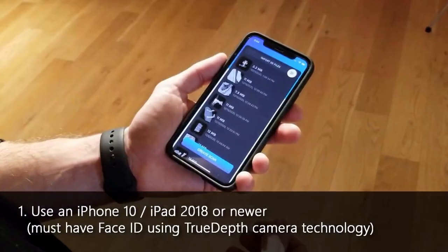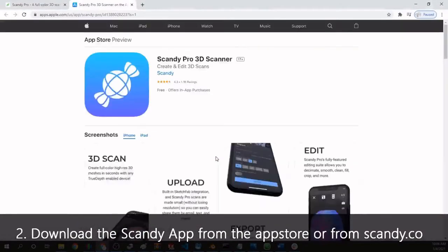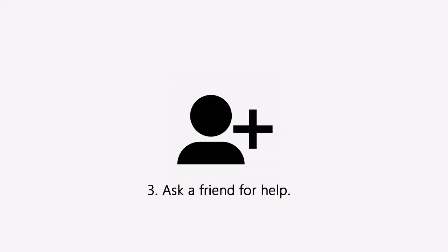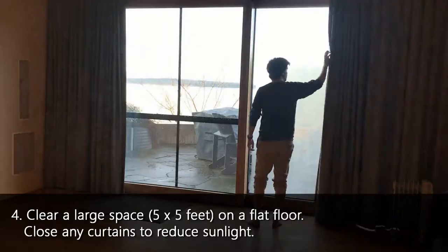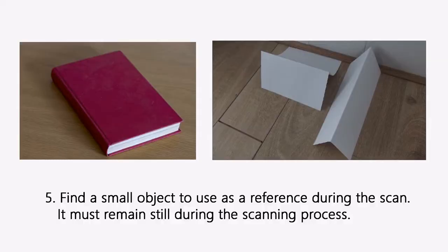To start, there are a handful of items you'll need to get a good foot scan. You'll need an iPhone X or higher, or an iPad 2018 or later. You'll need to download the Scandy app on your iPhone or iPad at www.scandy.co. You'll also need a second person to help with the scan, a flat surface, a large room with the ability to limit natural light, and a reference object such as a non-reflective book or folded piece of paper.